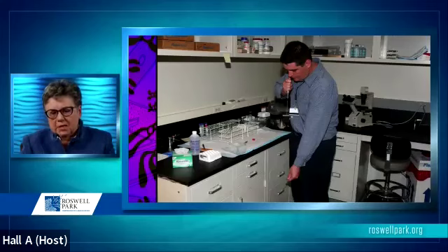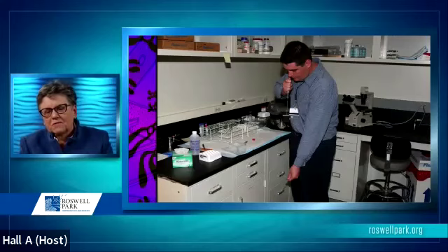And then the material is physically dropped onto a glass slide. That's where we tend to refer to this as an art as well as a science, because the technologist is spreading these chromosomes so that they are well separated. There is some instrumentation that helps us with the spreading. In those climates where it's very humid or very dry, we can control those conditions by using a controlled environment chamber, in which we can dial in whatever temperature and humidity we need for the spreading process.